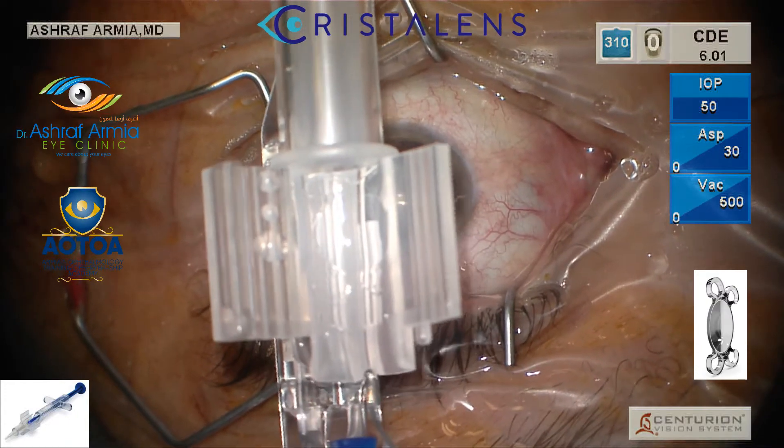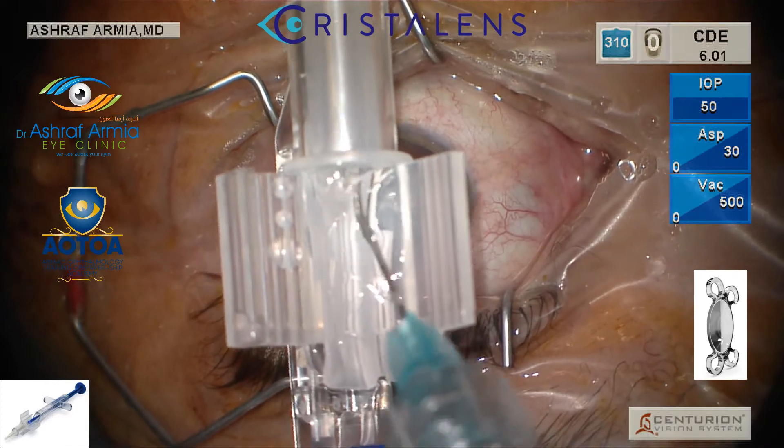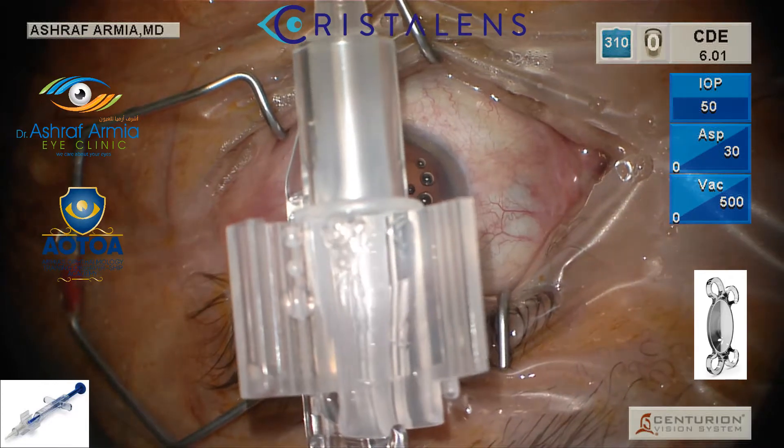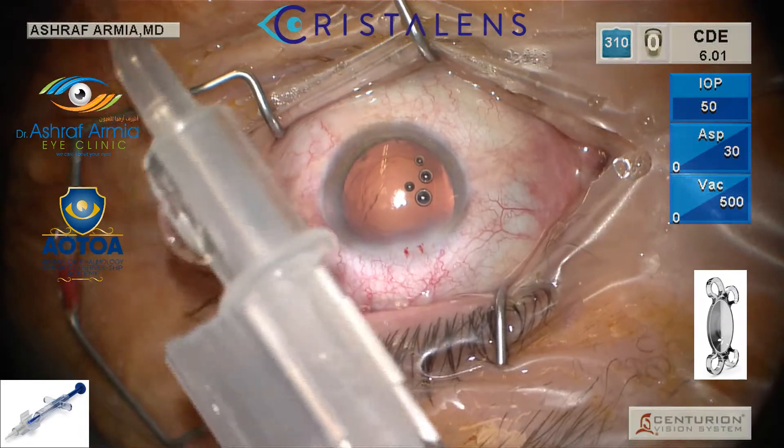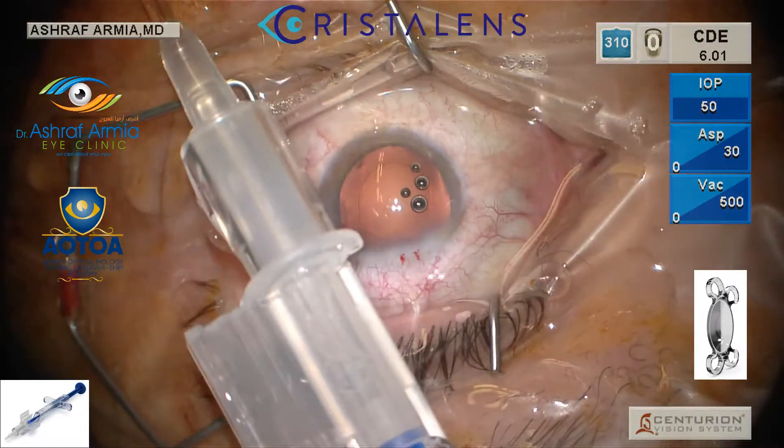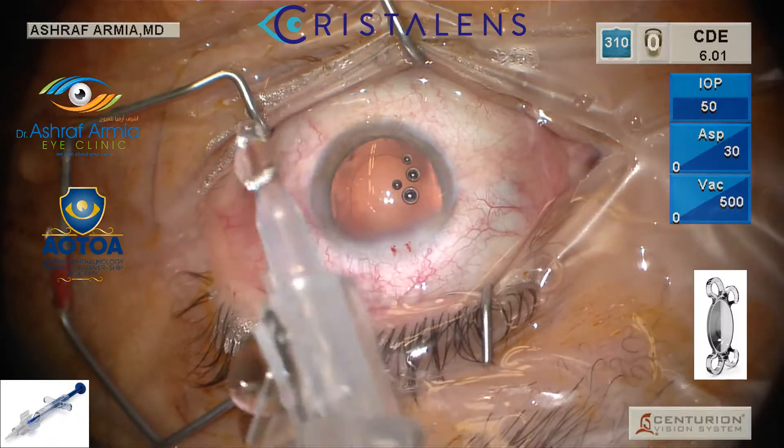Make sure to put a good amount of viscoelastic — this is very important to make it smoothly injected. Then the first click: you close the cartridge. This is the first click, and then you inject the plunger in until you hear the click.